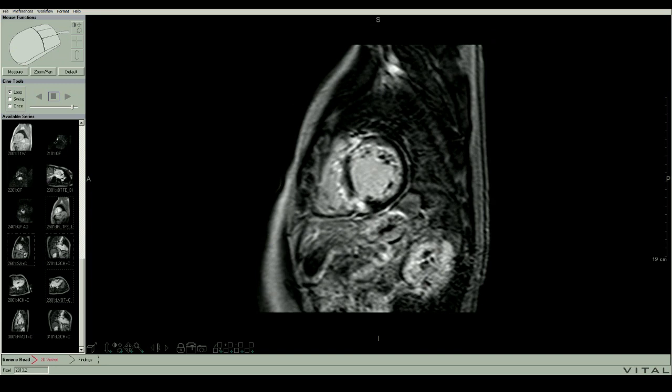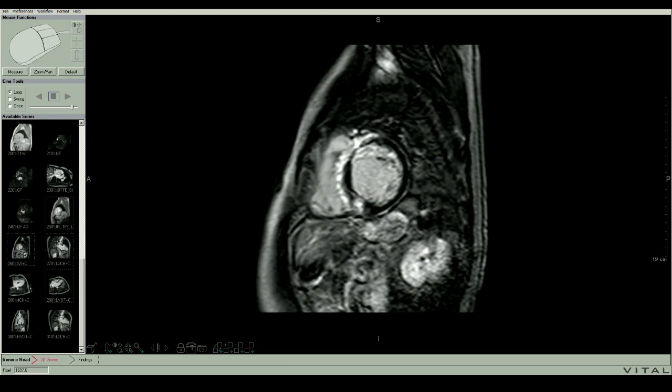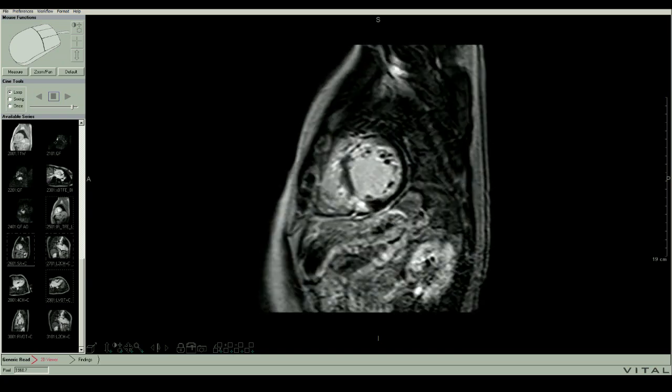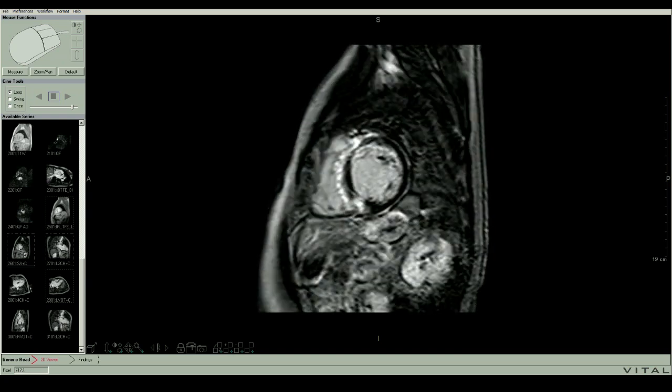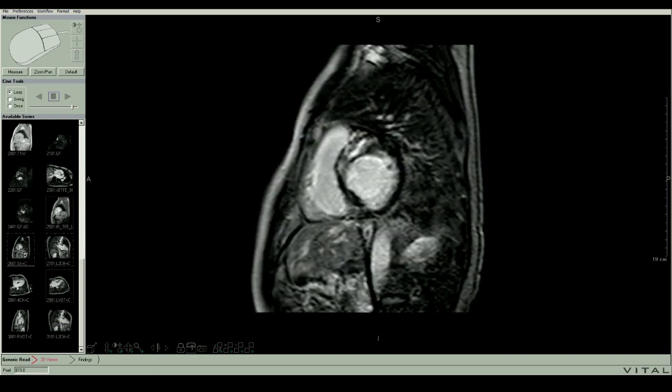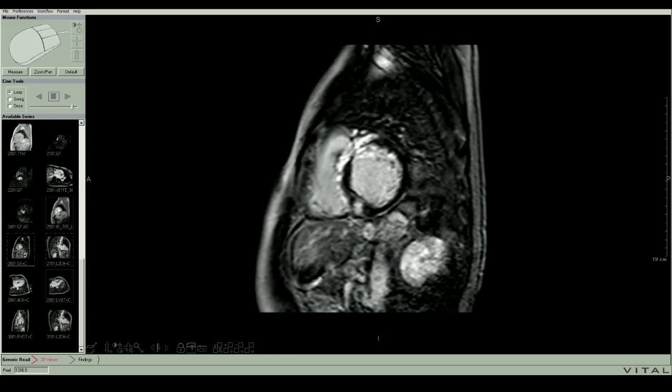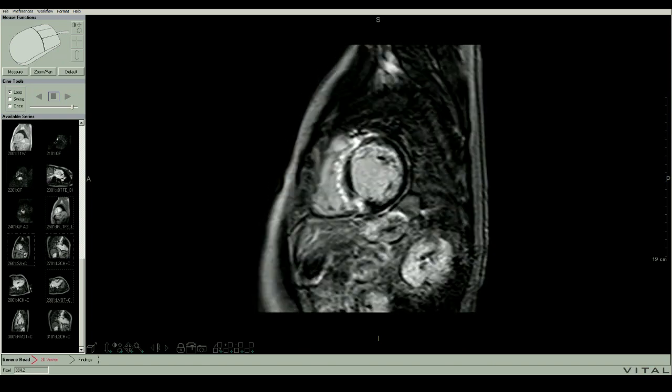The areas we saw with the Look-Locker involving inferior septum insertion, so to speak. You got the endocardial, subendocardial wall of the septum in the right ventricle. See that? Transmyocardial in terms of the septum. Almost transmyocardial down here. Doesn't quite get the epicardium. Right ventricular insertion point down here. Right ventricular insertion point up here. Another hunk, big chunk of interstitial gadolinium that's giving us these bright images.